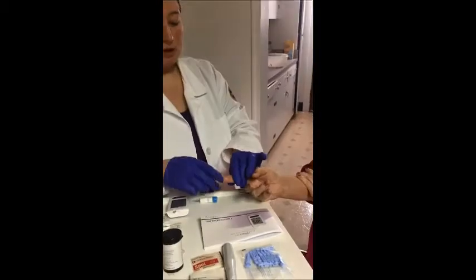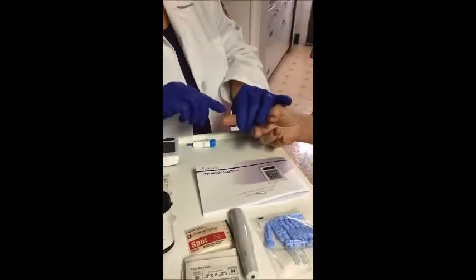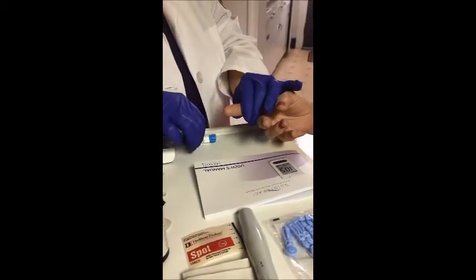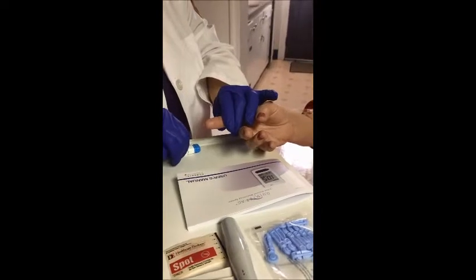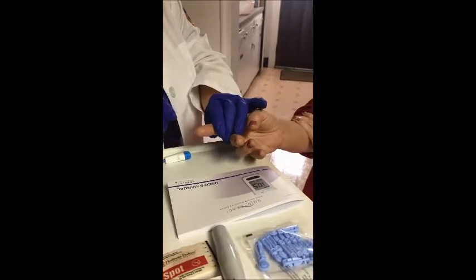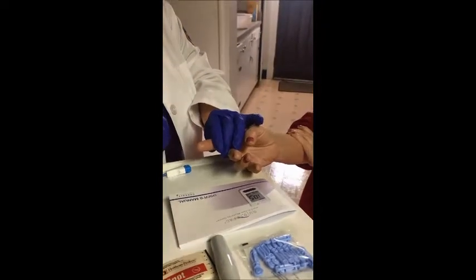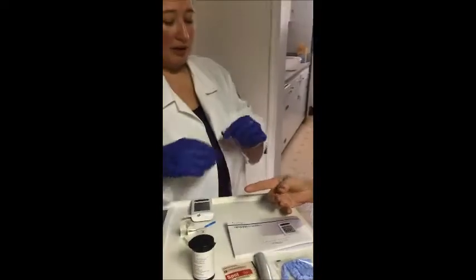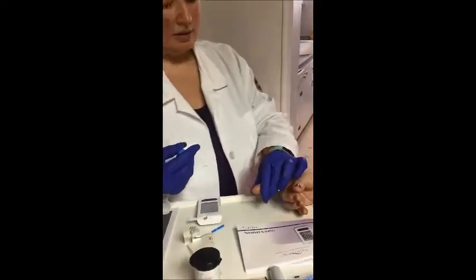We're going to choose the spot, which is this finger we've already cleaned. It's best to use the side of the finger instead of the top. It's less painful. And you'd want to, at home, use each different finger so you're not using the same finger more than once, because it does become painful after a while. If you turn and twist, this piece comes out, and then you're ready to stick your finger.